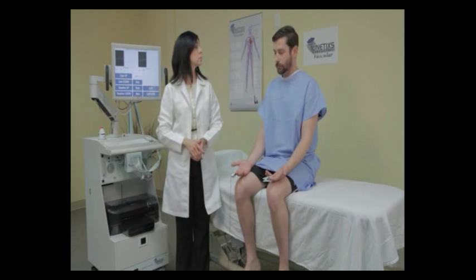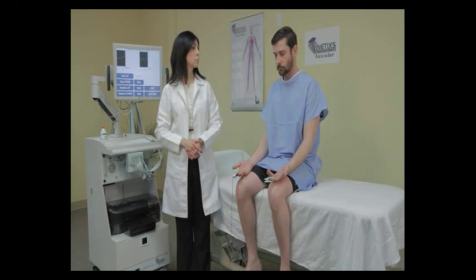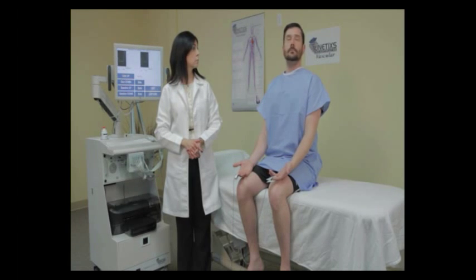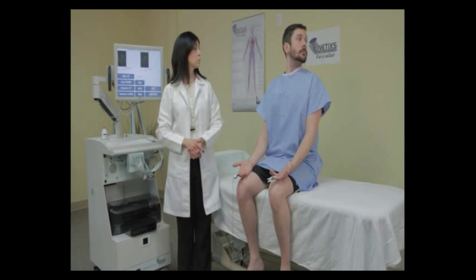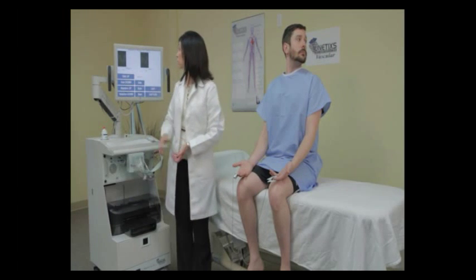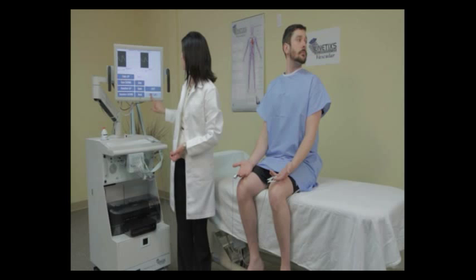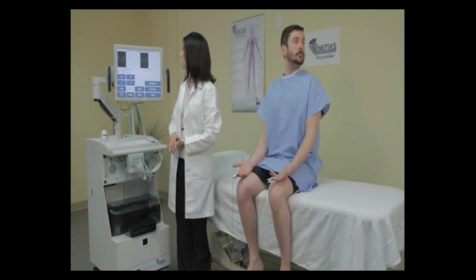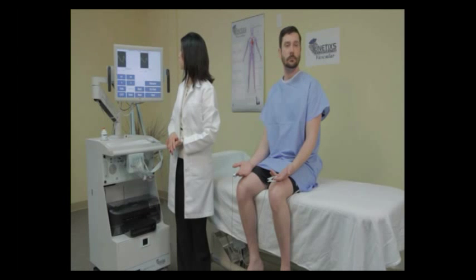The next position is the Adson's left maneuver. Ask the patient to take a deep breath and turn their head as far left as they can and hold. Observe the on-screen waveforms, and when they're consistent, press capture. If you see them getting smaller as the patient is doing the maneuver, wait until they become consistent.